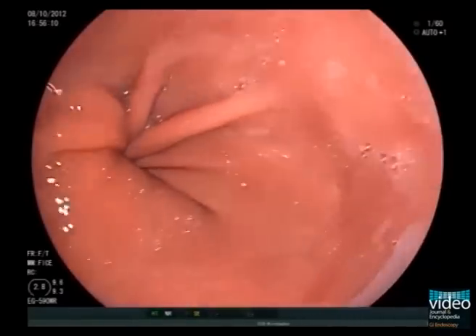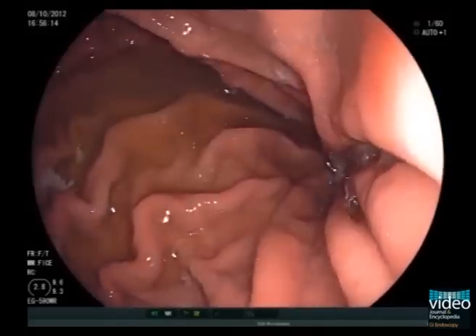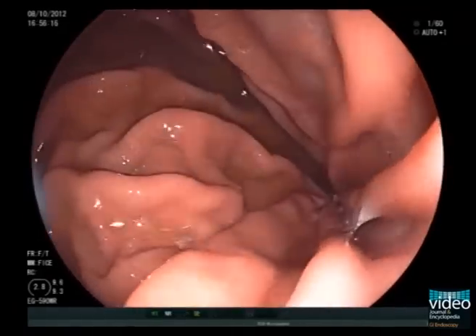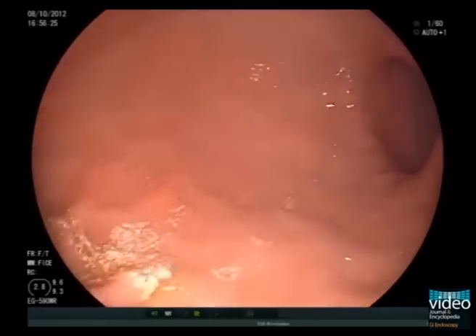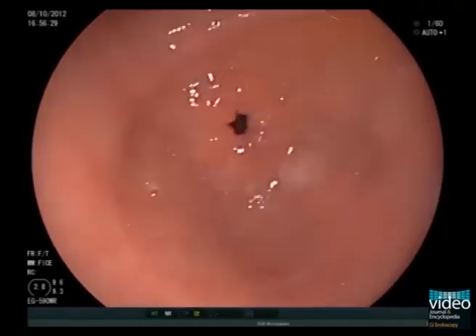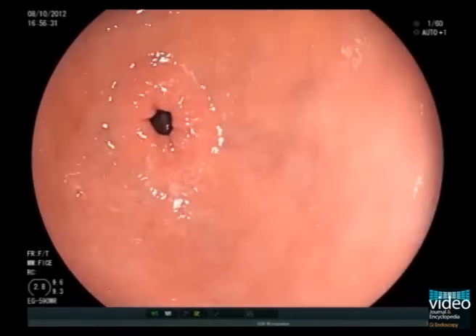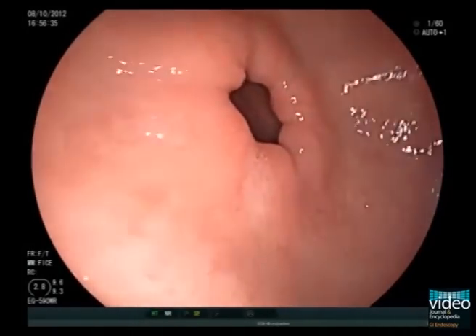Now advance the scope into the stomach and align the tip along the longitudinal axis of the stomach by means of a 60 to 90 degrees clockwise torquing manoeuvre. There are certainly many ways of examining the stomach. The important point is to be both systematic and deliberate so as to minimise the amount of unexamined surface area. Our approach in general is to observe the stomach in detail after the duodenum has been examined.